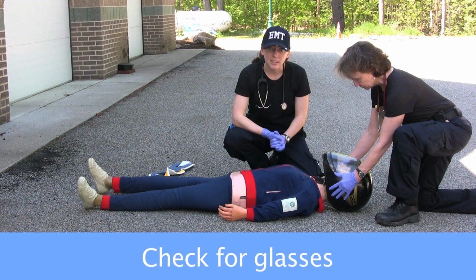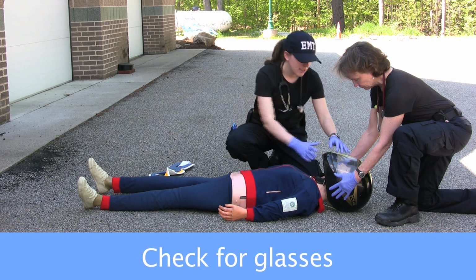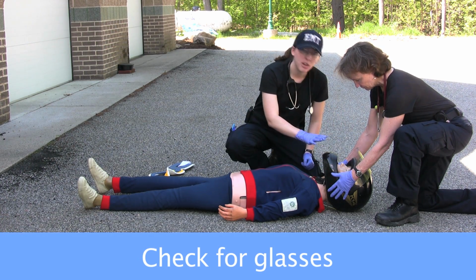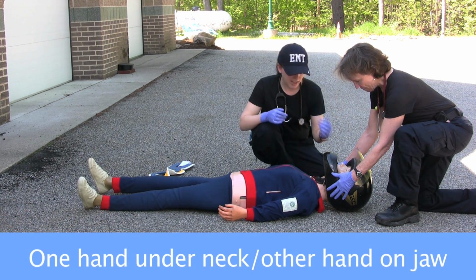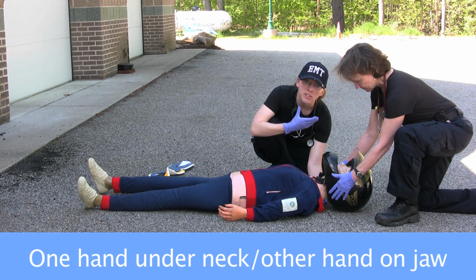So now that that's clear, I want to just double check and make sure she's not wearing any glasses, because it makes removing the helmet a little more difficult. We're good? So I'm going to go ahead and take over stabilization. One hand goes behind the neck, and one hand goes and holds on to the patient's jaw.